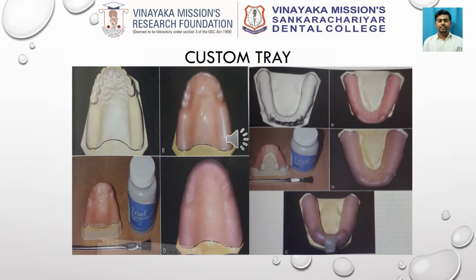So after placing the wax sheet or a double layered tin foil, the self-cure acrylic is molded on top of the tooth surface along the outlines, and the excess is cut and the tray handle is placed. The same is repeated for the mandible.